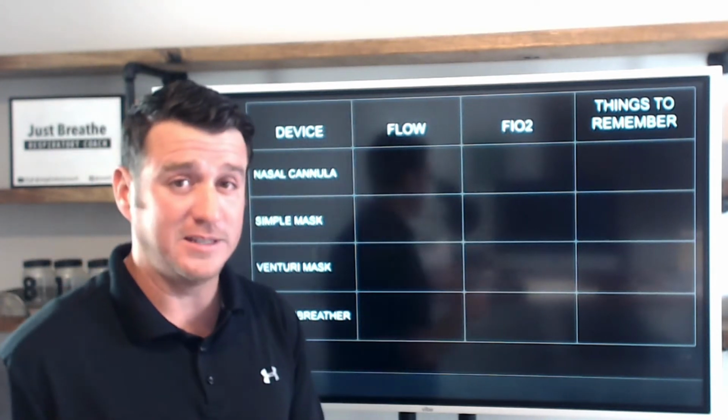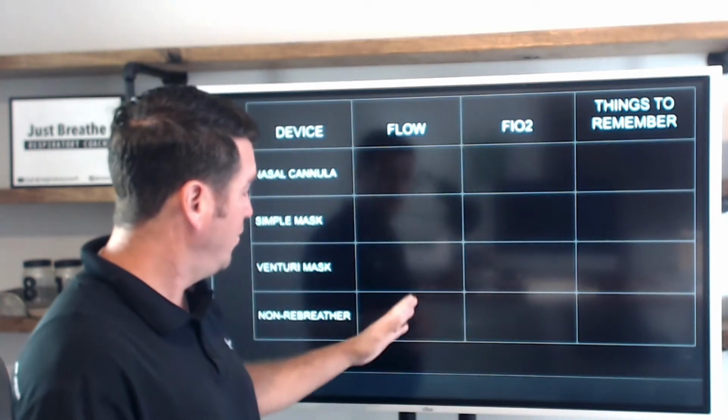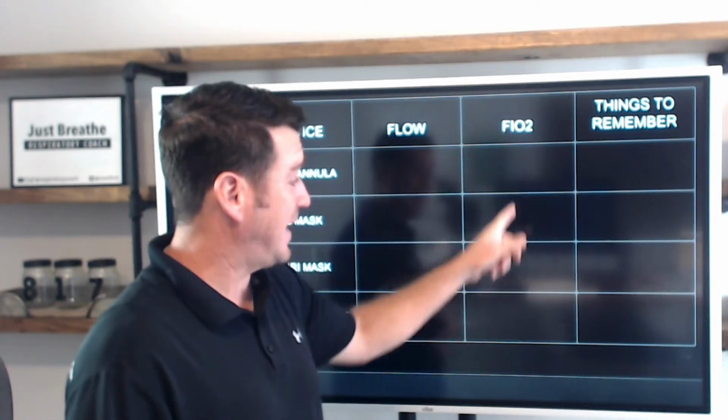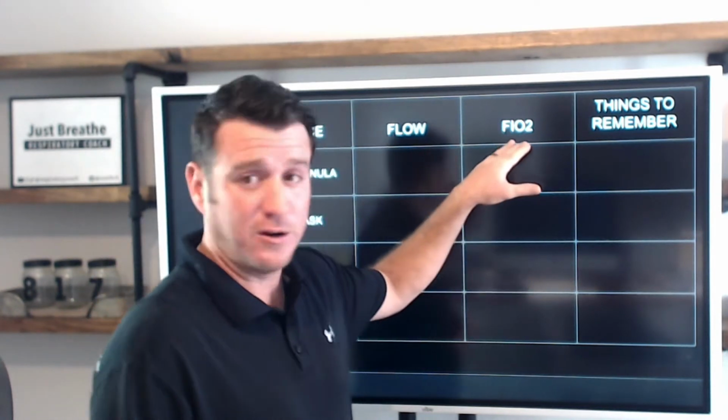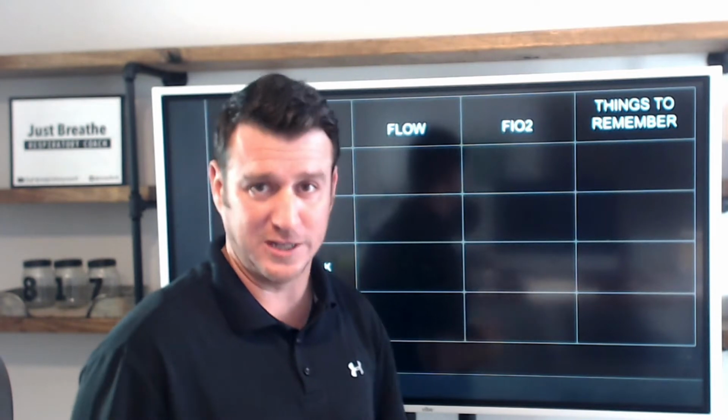Now, to talk about these, I'm going to break them down for you so that you have a better understanding of the flow that should be delivered for these devices, the FiO2 that they deliver. Now, when I say FiO2, that stands for fraction of inspired oxygen. It's the same as saying percentage of oxygen delivered.